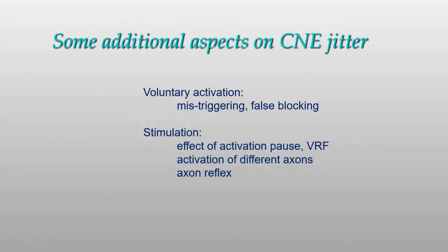At the end here, I would like to make some additional comments on details for the CNE jitter recordings. I will give examples from the studies with voluntary activation and with electrical stimulation.